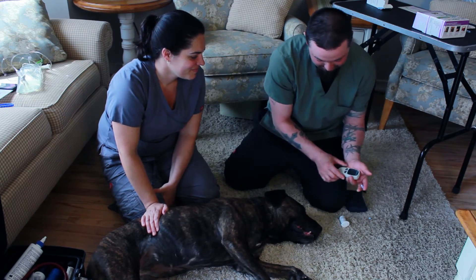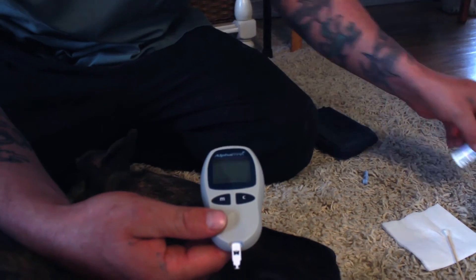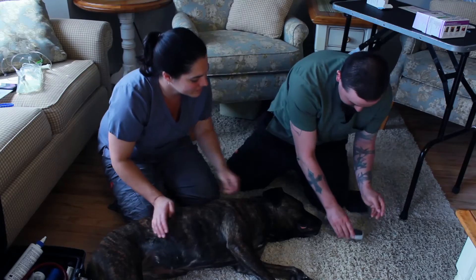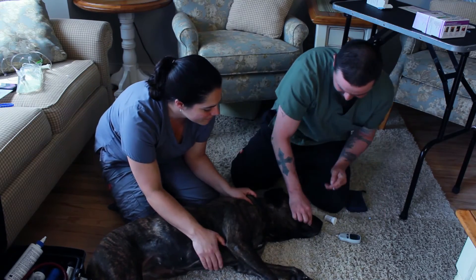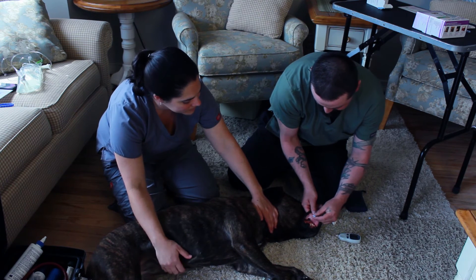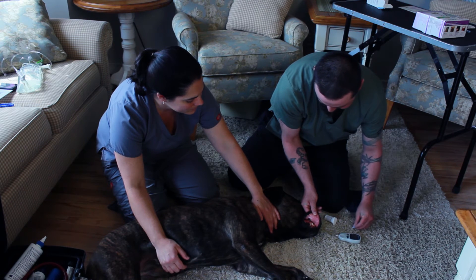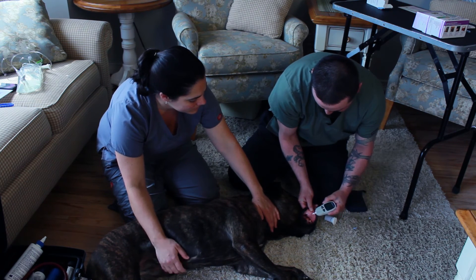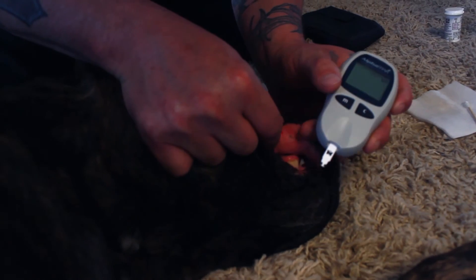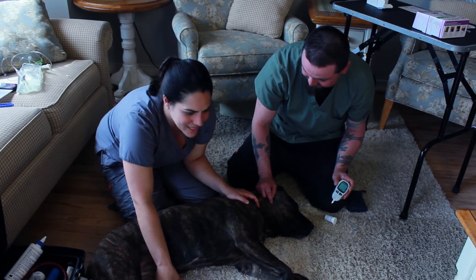So what I'm going to do is get my machine ready and insert the strip. I'm looking here to see dogs are number 36, which is the code that we're on now. I'll flip her lip over and as I slowly push the needle in I'm going to get a little twist and back out. The sample is coming out now and I'm going to touch the blood bead. My sample is reading and it's going to calculate a number for me — 73. Not diabetic.